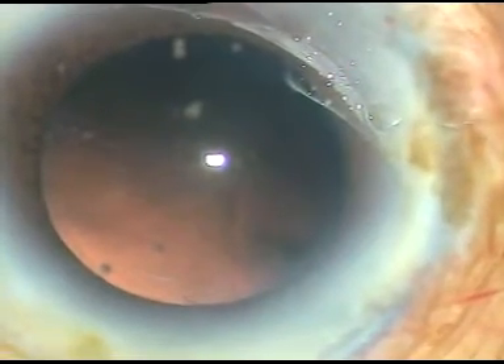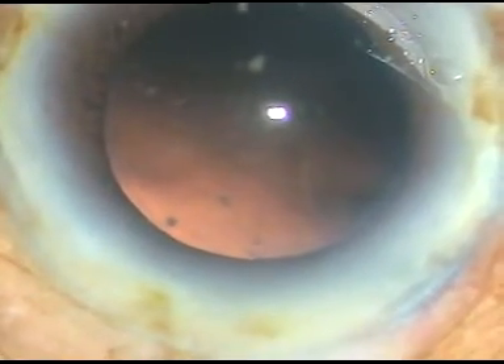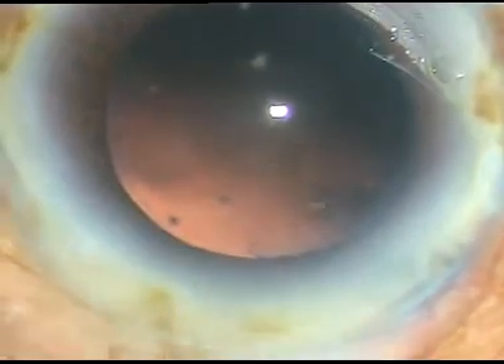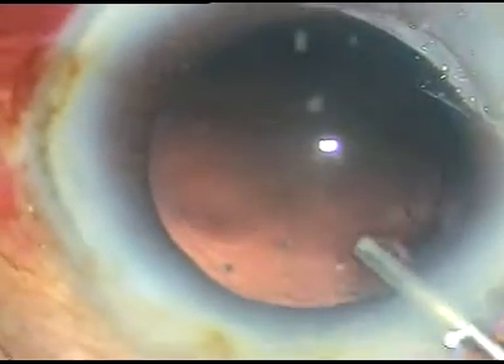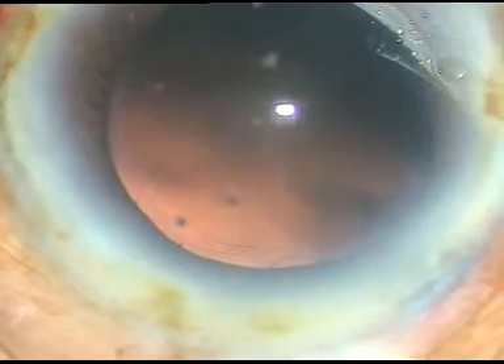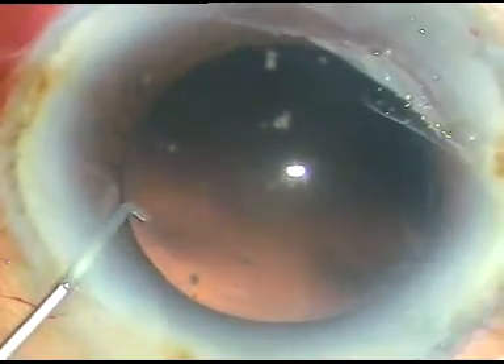So I just have to implant an intraocular lens now. The entire chamber is filled up with viscoelastic substance — HPMC again. This is a hydrophilic acrylic intraocular lens. The leading haptic goes into the capsule bag. The chopper supports the optic. The trailing haptic also goes into the bag with the chopper.